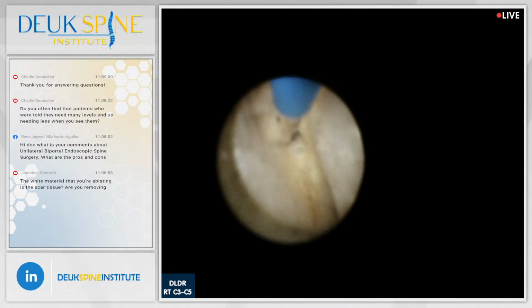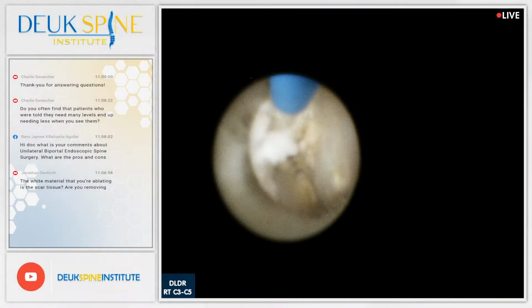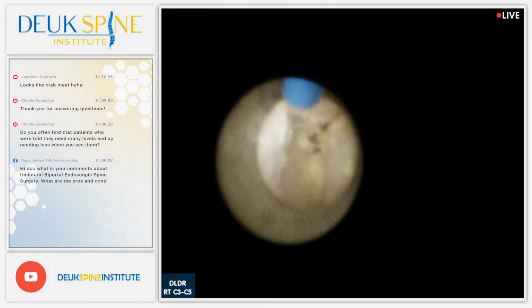All right. Almost done. Just need a little more work over here in the foramen.